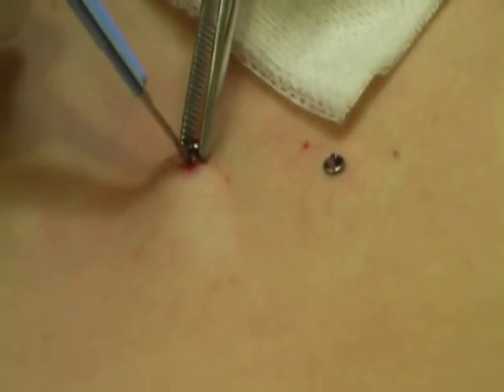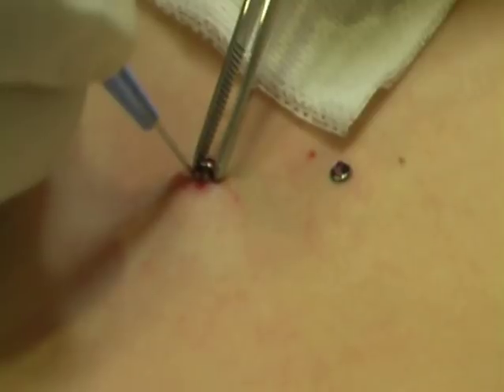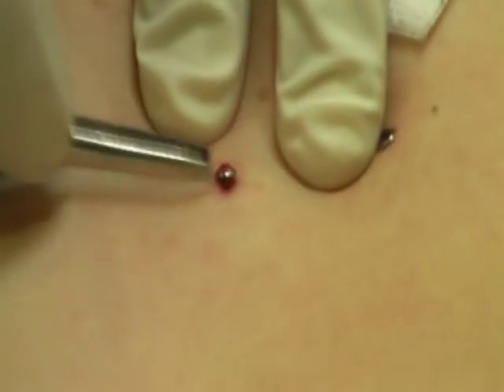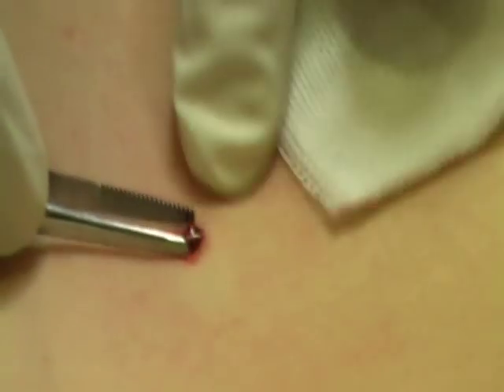So what I'm doing, I'm just gently trying to separate. Unfortunately it's very difficult to tell. The trick is, it's very easy to go in and make a nice big cut and just take the whole thing out quickly — but unfortunately if you do that you're actually going to leave it with more scarring.